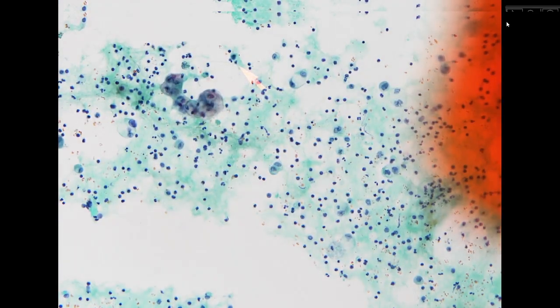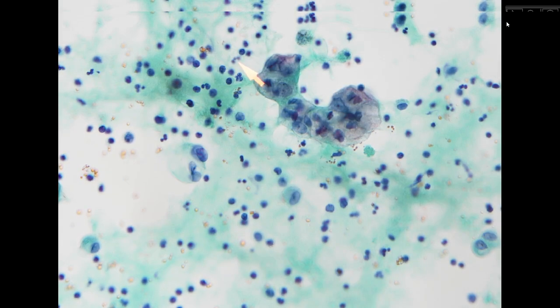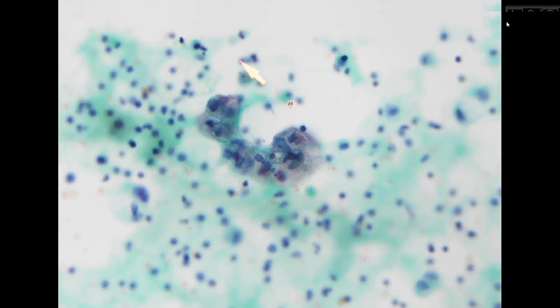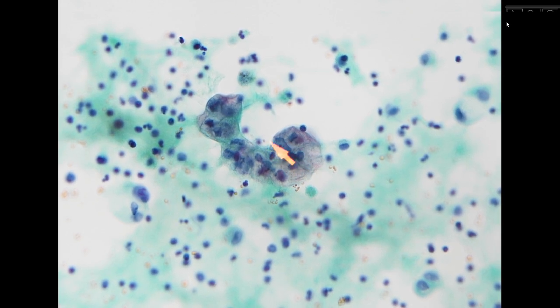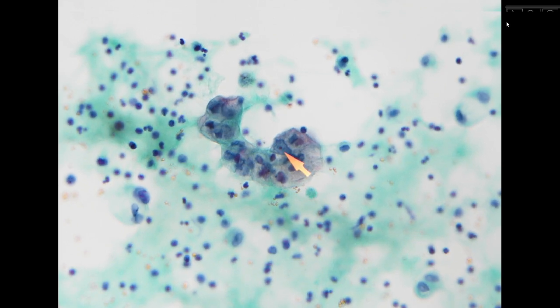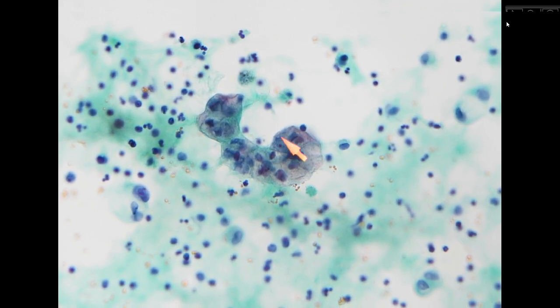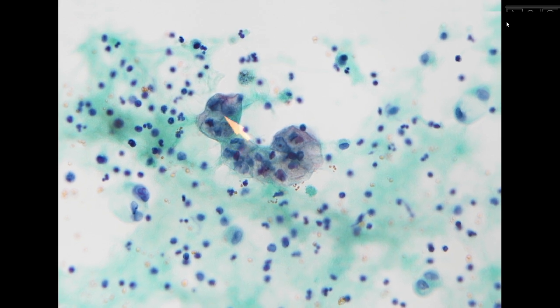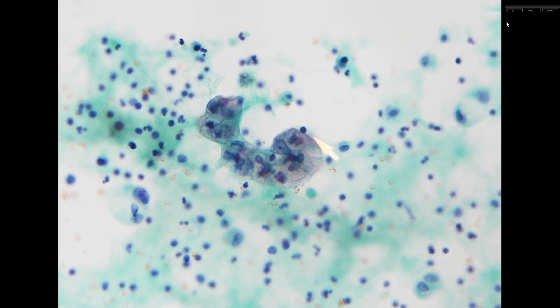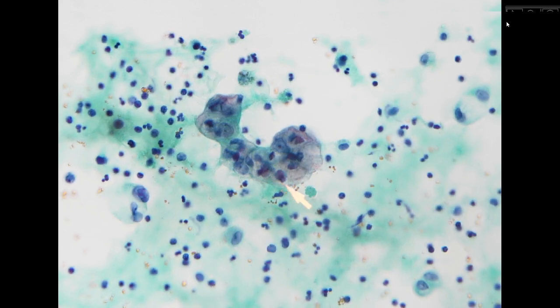When we go to higher power to see this cluster, it is very obvious that we can appreciate nuclear atypia. The nucleus is actually triangle shaped with prominent nucleoli and vesicular chromatin. So this looks like an adenocarcinoma with a three-dimensional glandular architecture. What is not common is that in the cytoplasm, we can appreciate plenty of intracytoplasmic mucin.